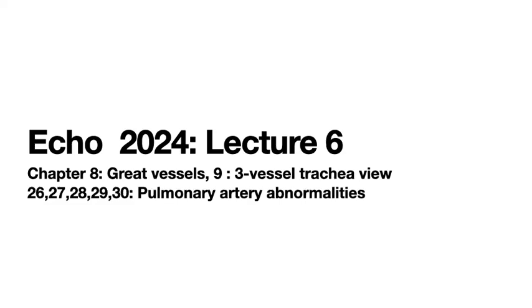All right, welcome to the second half of the 10 lectures on fetal echo. Here we go with lecture 6. We start off with a couple chapters on just the technical views, and then we'll move on to 5 chapters that include abnormalities of the pulmonary artery.